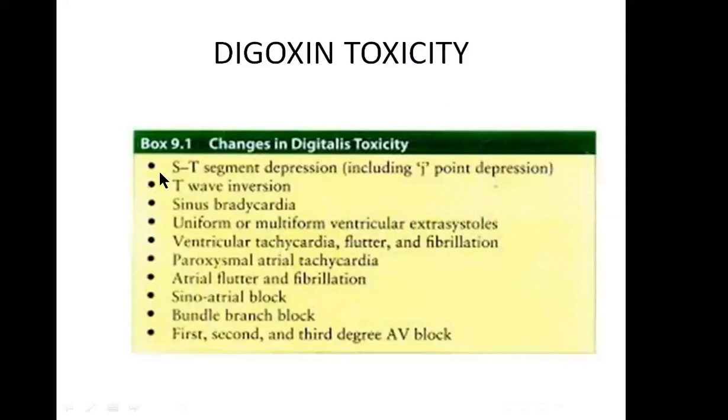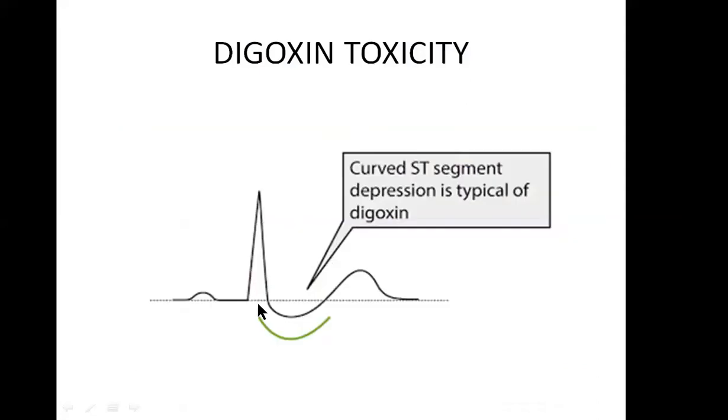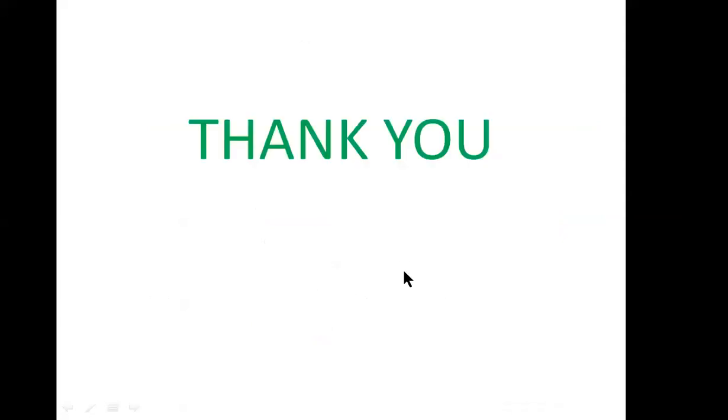Okay, friends. These are the changes in digitalis. I just want to stress this ST segment depression. This is the reverse tick sign, which occurs in digitalis or digoxin toxicity.